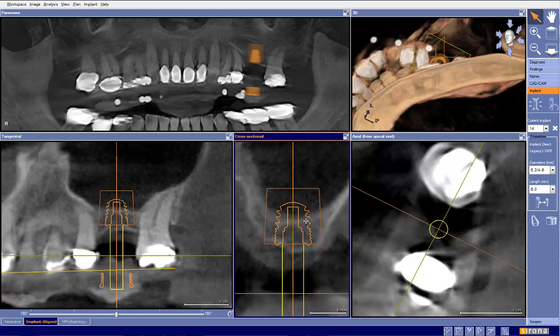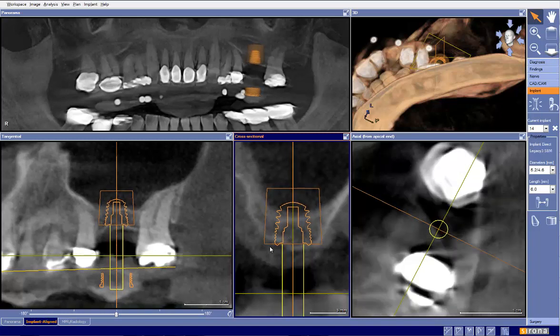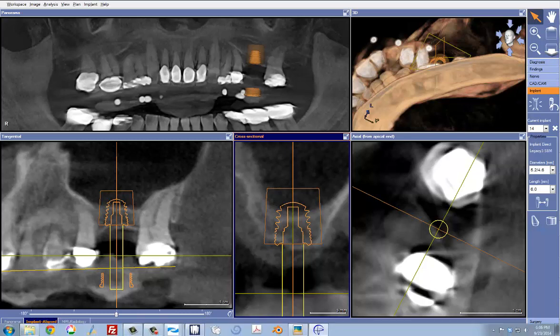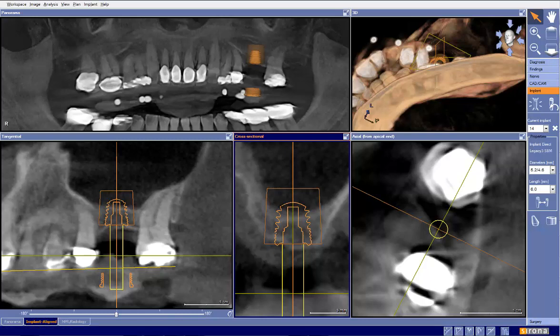This dentist has planned for a 5.2 by 6 millimeter implant. Literature does show that short implants certainly work. If you don't want to lift as much, we could put the implant right here — we have very thick tissue here, so we can have a little bit of the implant sticking out on the palatal, while still being completely covered on the buccal. Now we probably only have to drill maybe 4 millimeters of the 6 millimeter implant and then lift the sinus about 3 to 4 millimeters, which I think is very possible with care and good technique. Hopefully this makes sense, and thank you for sending in this case.